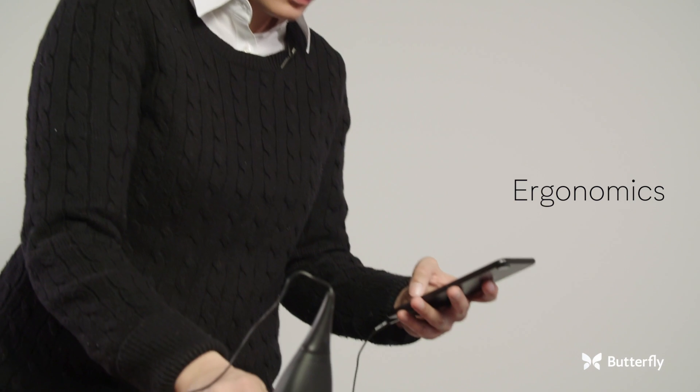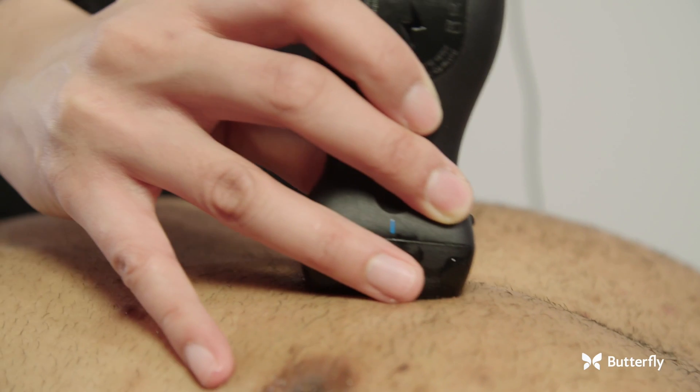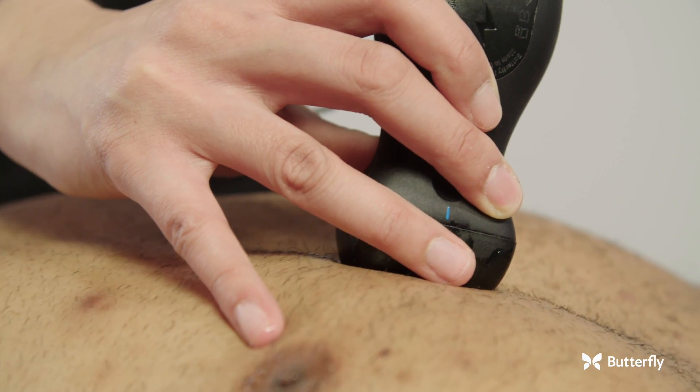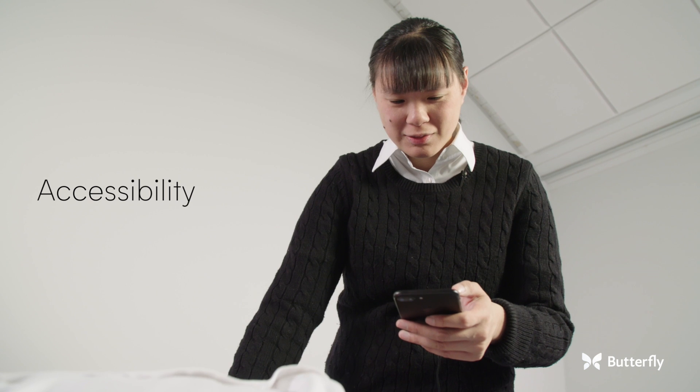The IQ ergonomics is great. It's not too cumbersome. It's big enough for me to get a good solid grip in my hand. It's a little on the weightier side, which I like. It doesn't get too hot and it doesn't have a very obtrusive cord. It would be great to have something I can just carry on me so that I can use it when I need to, and not go hunting for a machine.